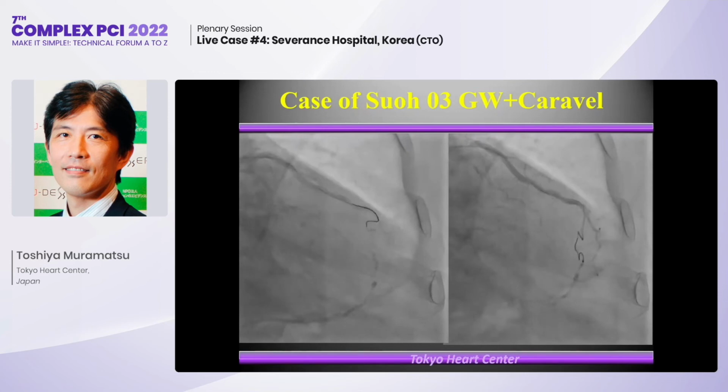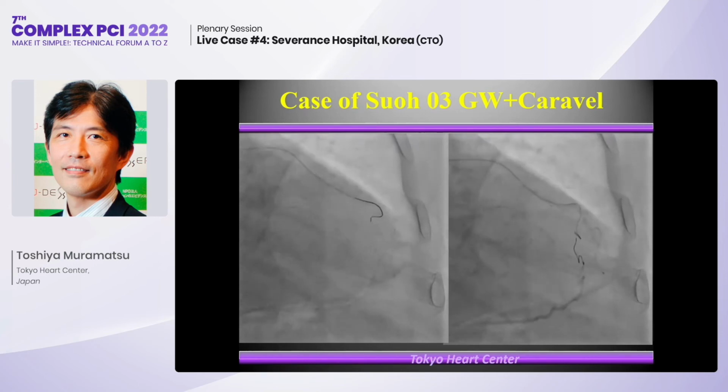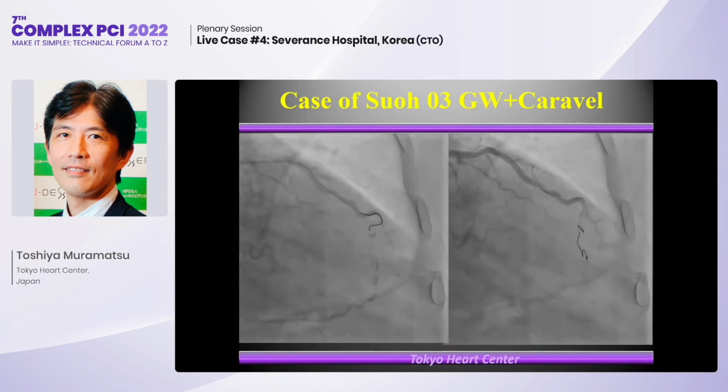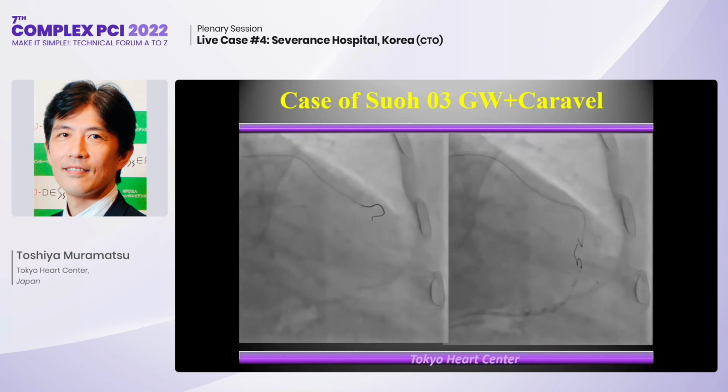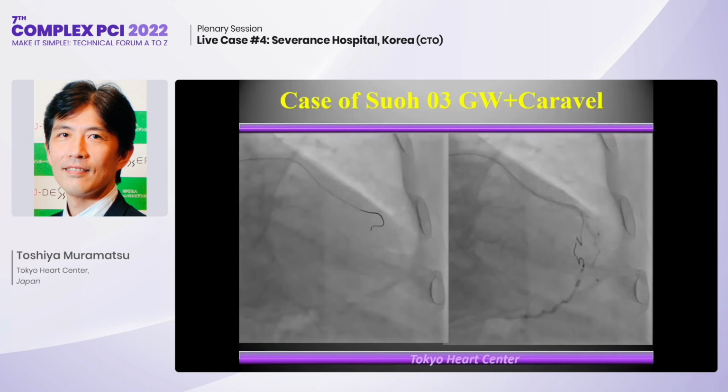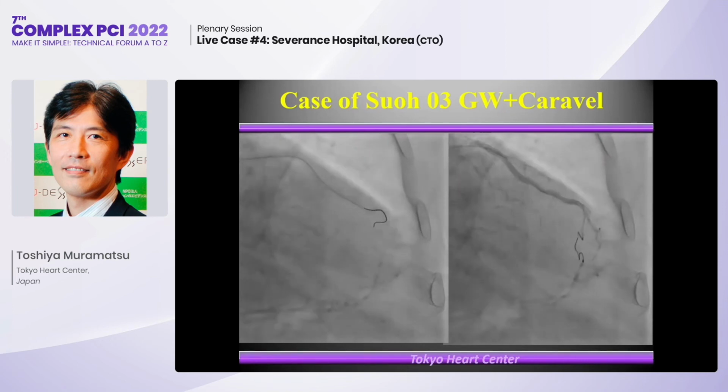And we changed to try the LAD epicardial channel using the SUOH 03 plus a Caravel microcatheter, and gently tried to advance it to the distal part. Sometimes we check angiography and carefully point toward the distal epicardial channel.